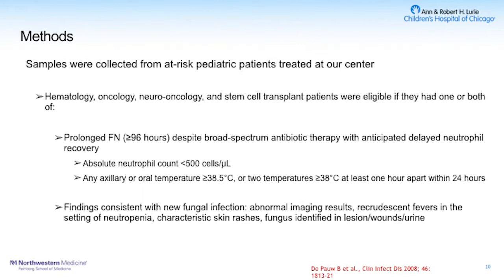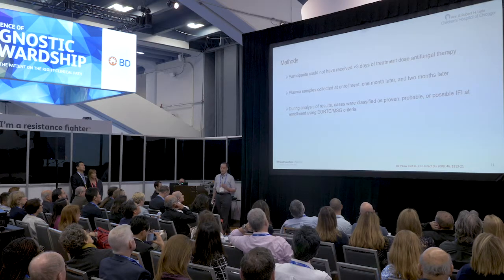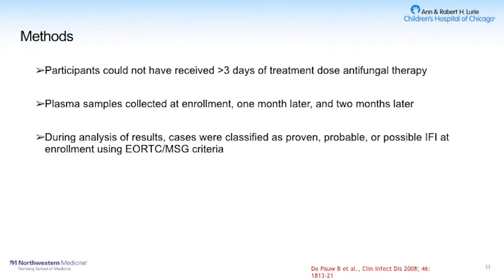therapy, or they had findings that would be consistent with the diagnosis of a new fungal infection, including abnormal imaging, recurrent fevers in the setting of neutropenia, a characteristic skin rash, or if a fungus was identified in what was potentially a non-sterile site, such as a skin lesion or in urine. We did not enroll patients if they had been treated for more than 3 days with a treatment dose of antifungals, but if they were receiving prophylactic antifungals, they were actually eligible to be enrolled.